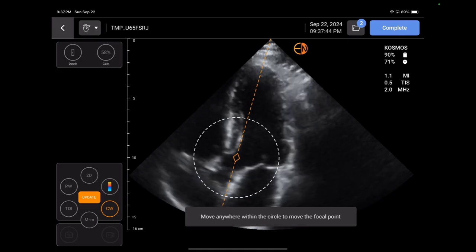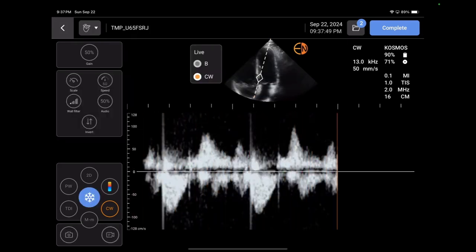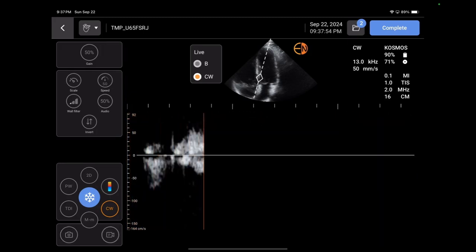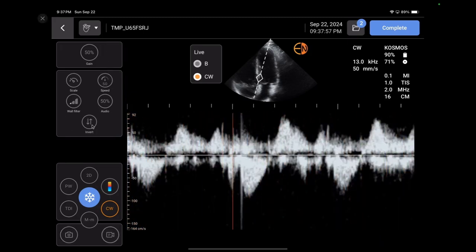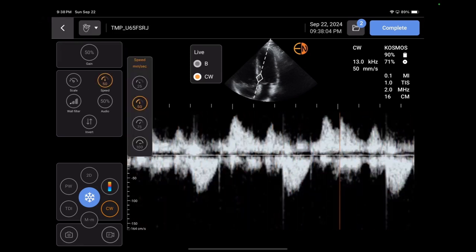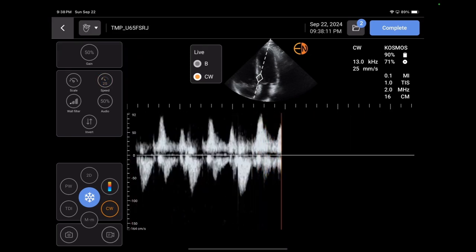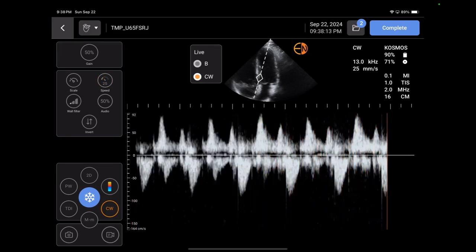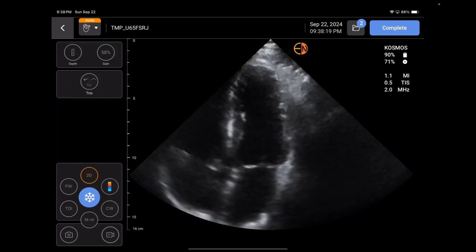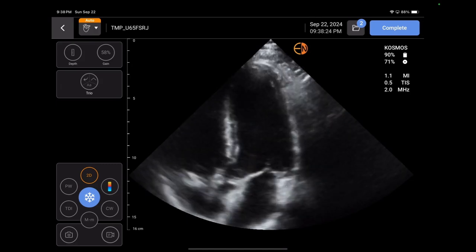I press continuous wave and it gets me right through the aortic valve. You can see that looks just like a regular echo. I can change the baseline, adjust all the settings I want, change the audio, and change the sweep speed to be higher or lower — however I need it to do my appropriate echo. It's really like doing a full echo on a regular cart-based machine. That's fantastic.